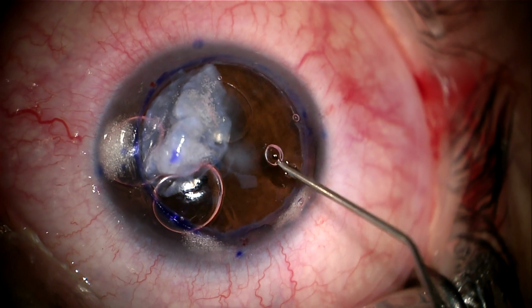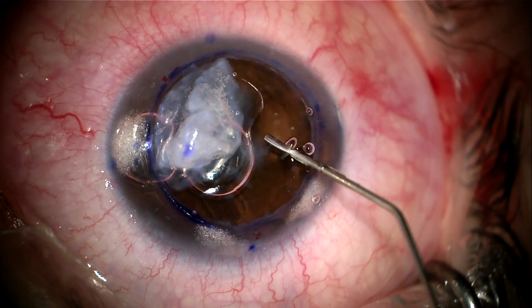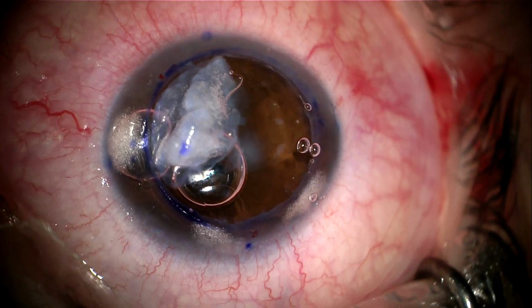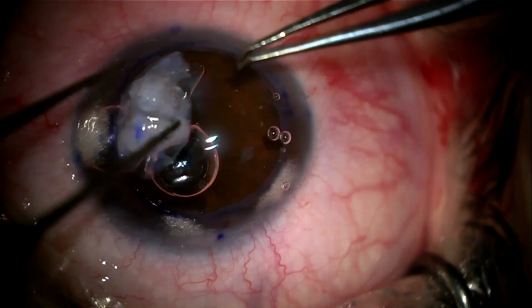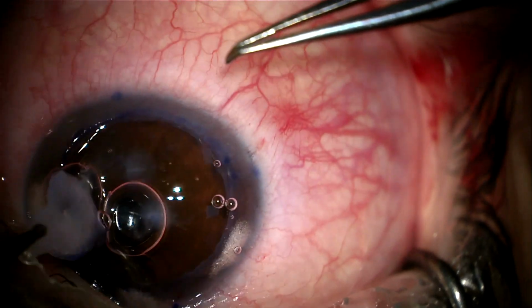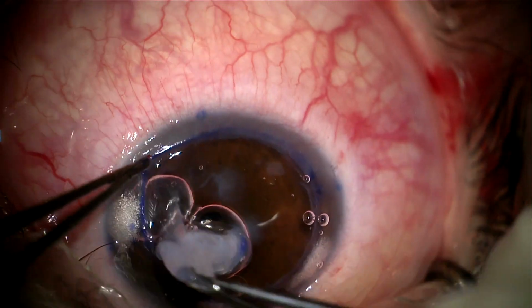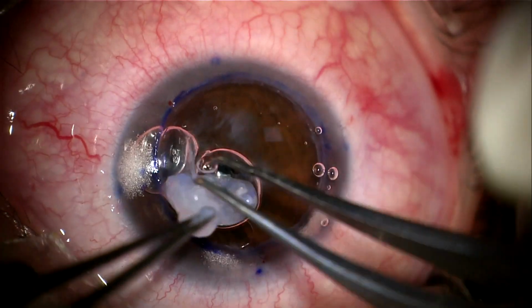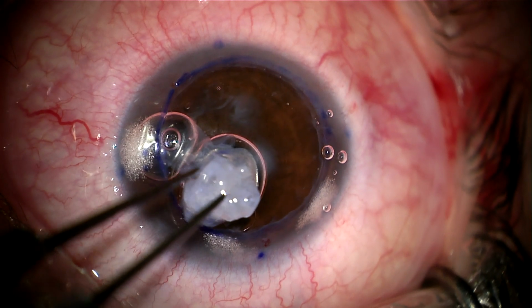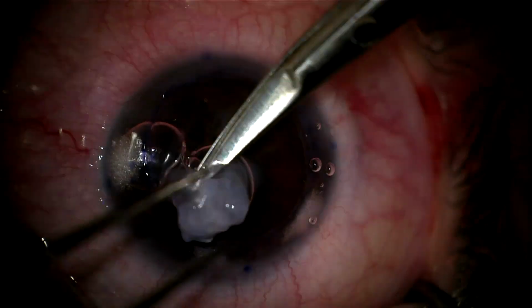Now we come to the last and most important step in the surgery, which is baring of Descemet membrane. It's obvious that the scar is involving the predescemetic layer, and to achieve optimal visual outcome we have to bare Descemet membrane. Complete baring of Descemet membrane carries a very high risk of rupture and conversion to penetrating keratoplasty.